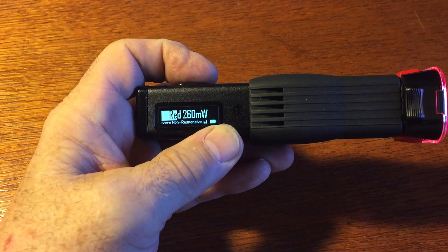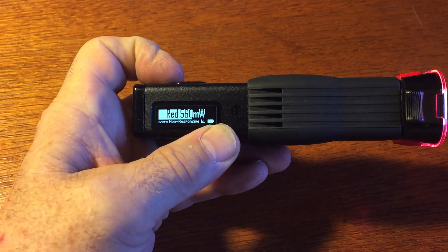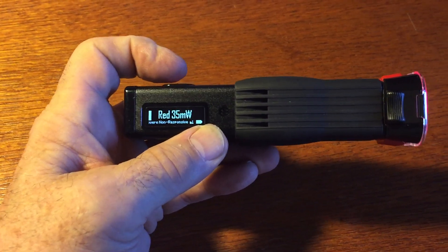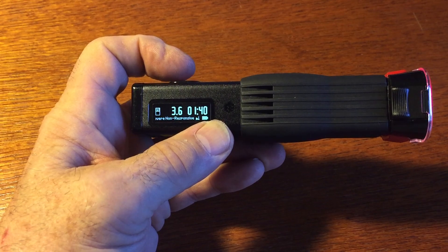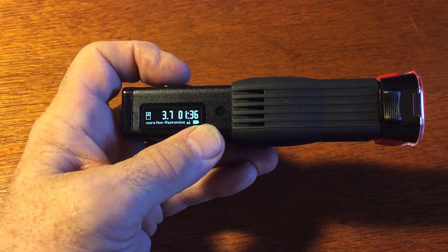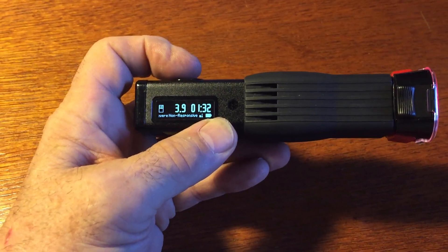We can crank it up or down for power, depending upon what it is that we want to do, which allows unlimited amounts of application. The classic 35 milliwatts is a good example. It tells us how much fluence is being delivered. You can have it turn off when you want, based on level or time.